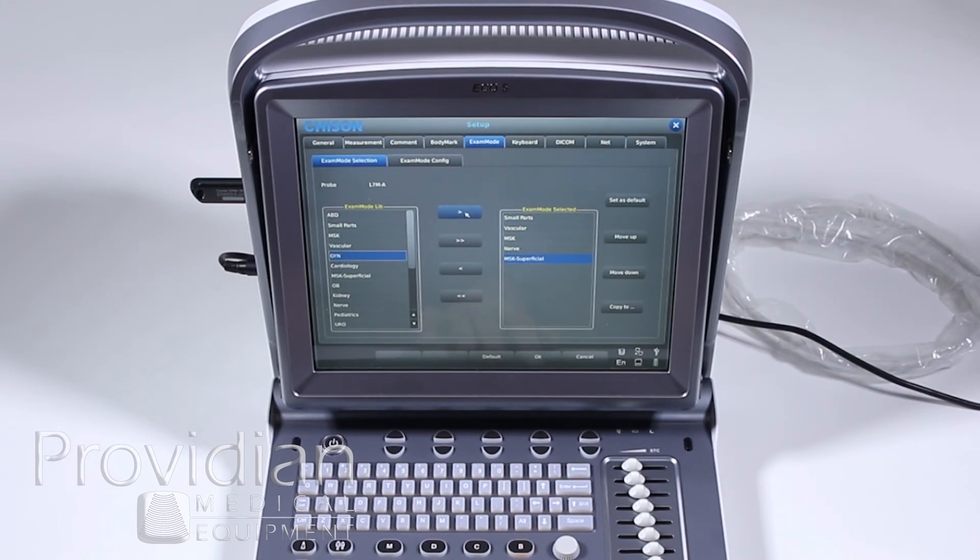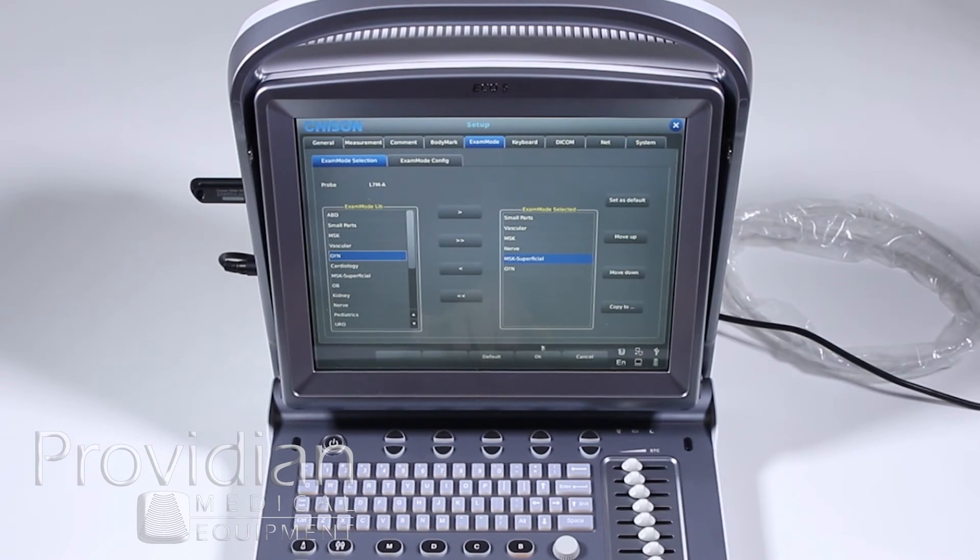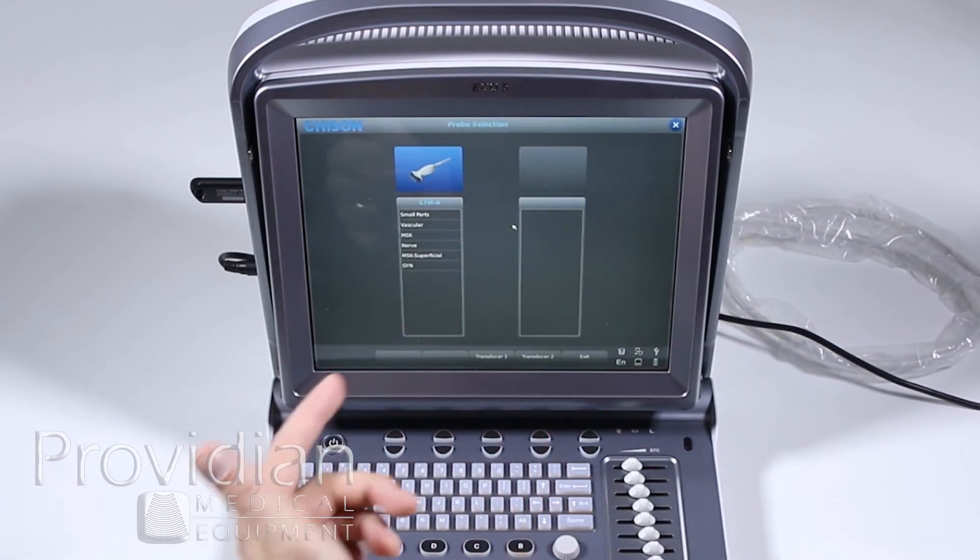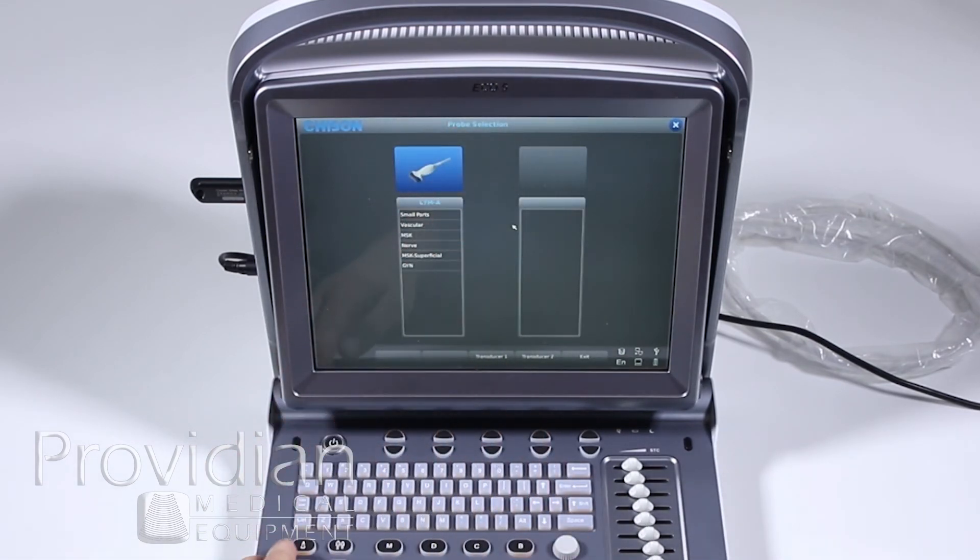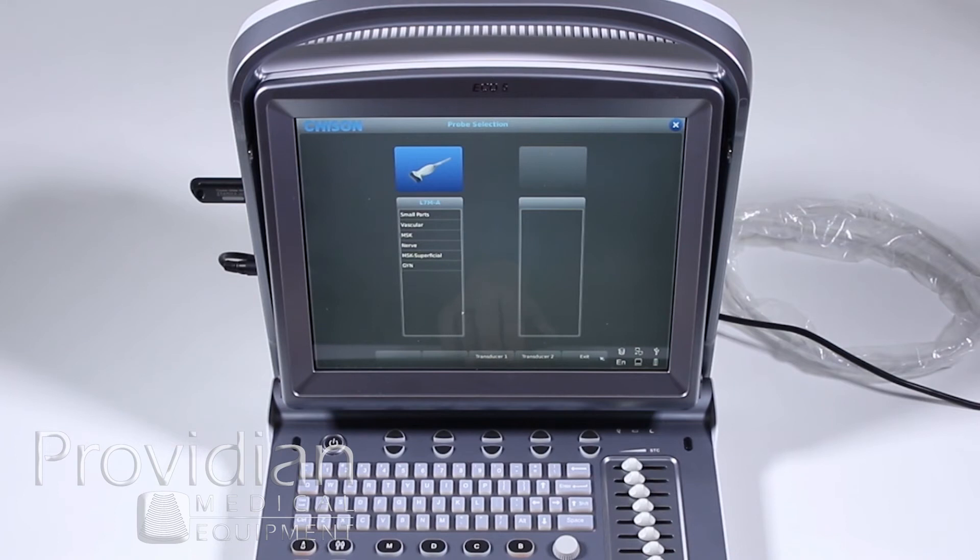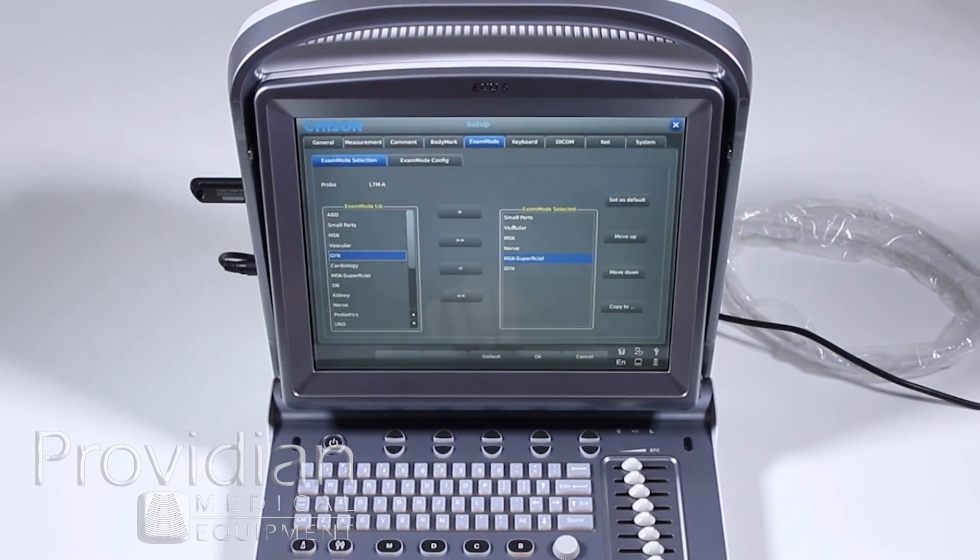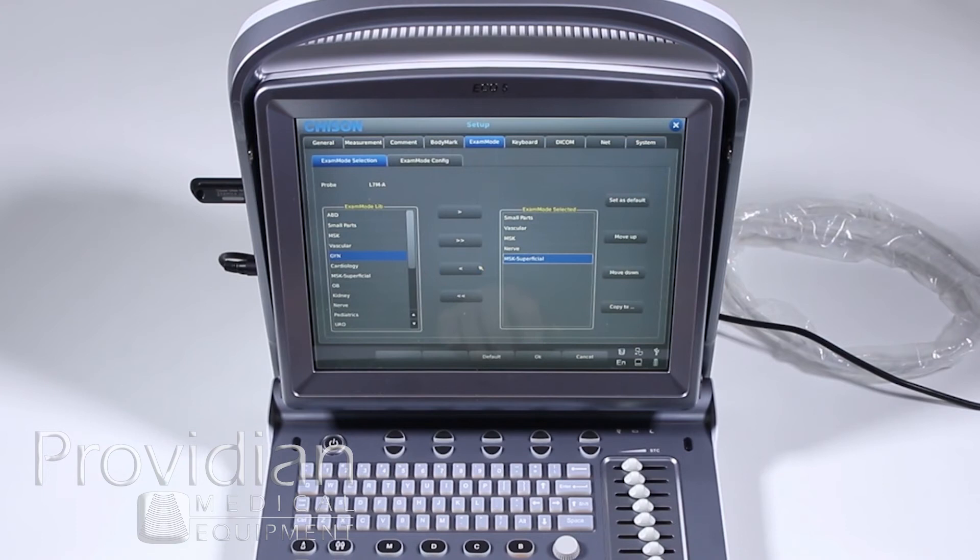And now, when I go to GYN, I'm going to go ahead and click OK. If I hit Probe, now GYN is going to show up when I select that probe. But I don't really want that. I'm going to go ahead and exit, back to the setup, and let's see. I just want that off of there.